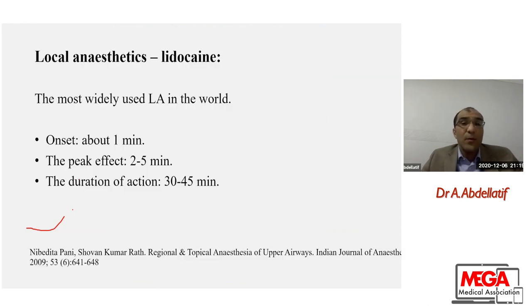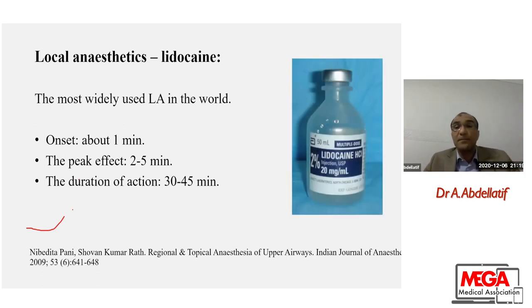And what if I have a patient like this with a huge goiter or a huge neck tumor? There are no landmarks for any block techniques. So I prefer the topicalization method. Of course, the most common drug we use is lidocaine. The onset is about 1 minute, the peak effect in 2 to 5 minutes, and the duration of action from 30 to 45 minutes.